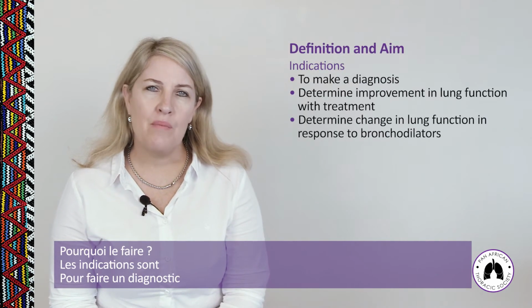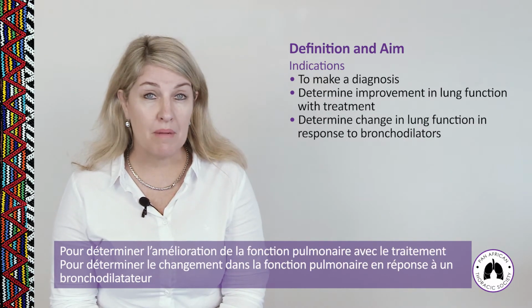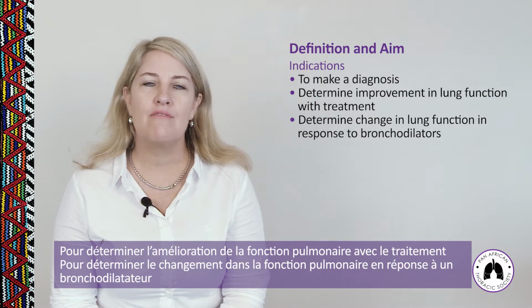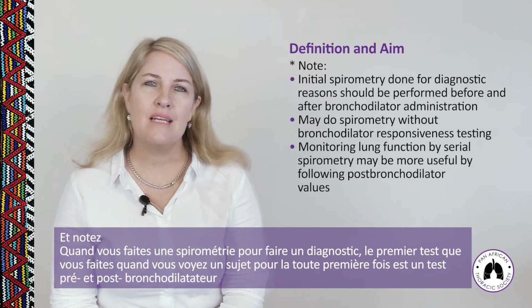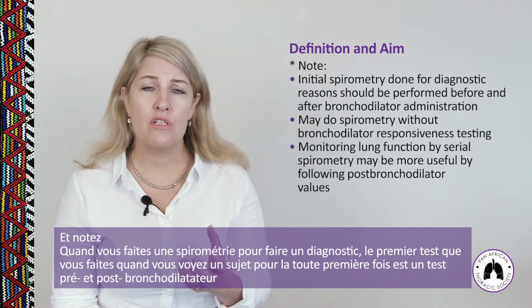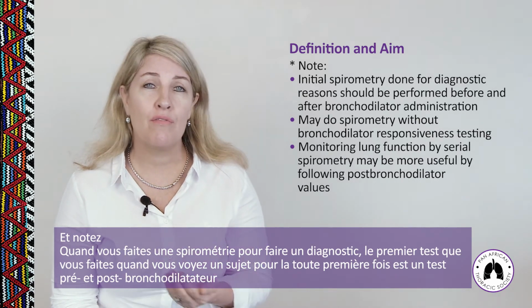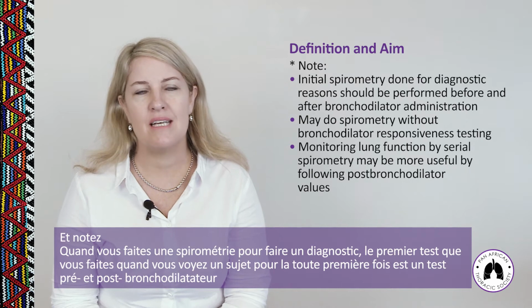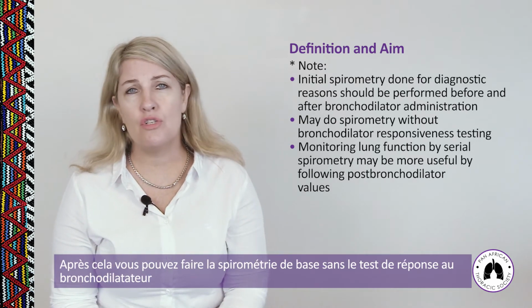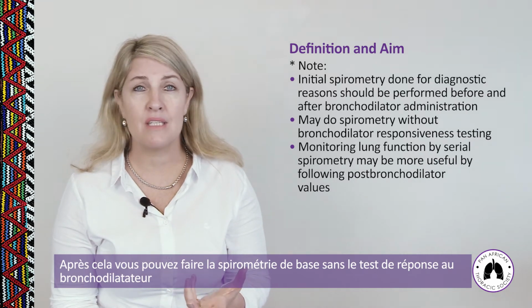So the reason why we would do it, the indications, are to make a diagnosis, determine improvement in lung function with treatment, determine change in lung function in response to bronchodilators. And please note that when you are doing spirometry for diagnostic reasons, the very first one that you do when you see a patient for the very first time is a pre and post bronchodilator responsiveness test. Thereafter, you can just do a straightforward baseline spirometry without the bronchodilator responsiveness testing.